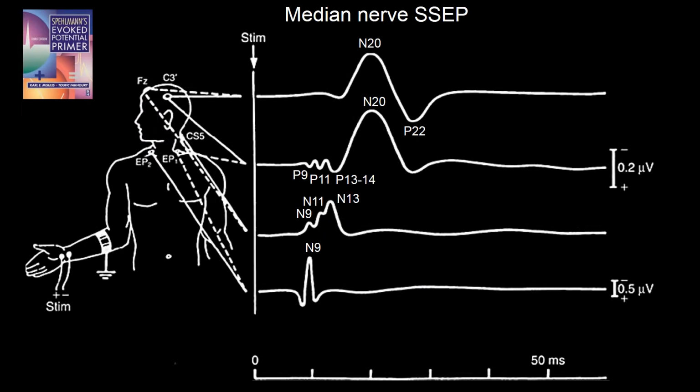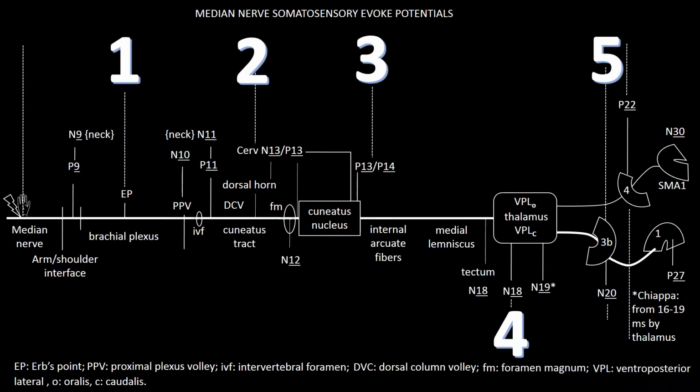And the same here, you can see that the number of potentials labeled are far more than 5. In this figure, I have placed big numbers corresponding to the clinically important potentials to which I have alluded before. The other potentials I have just labeled. As you can see, certain potentials have multiple names given to them with more or less good reasons, according to my humble opinion, by different authors. To make this figure more complex, I have added for certain potentials more than one origin, again following different authors' consideration. I hope that during the course of this talk, this figure will become more and more clear to you than it looks at the moment.